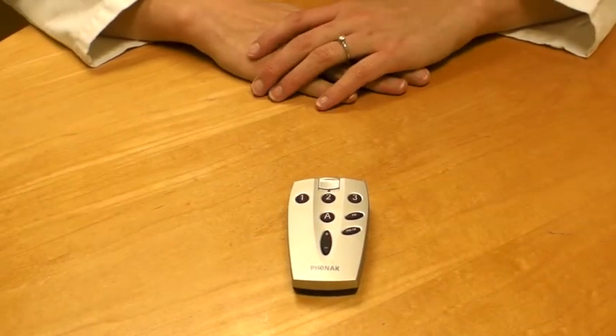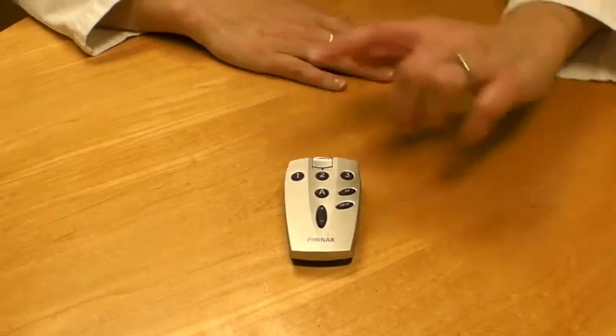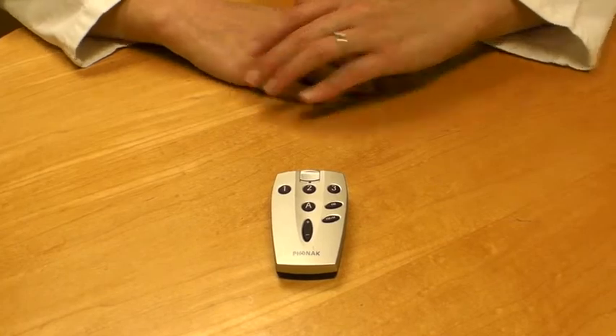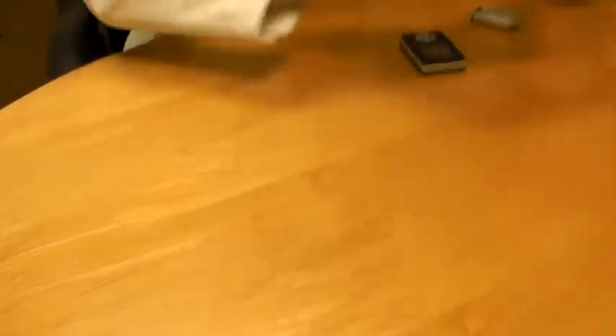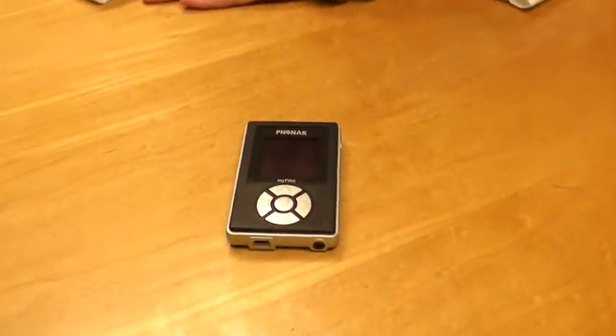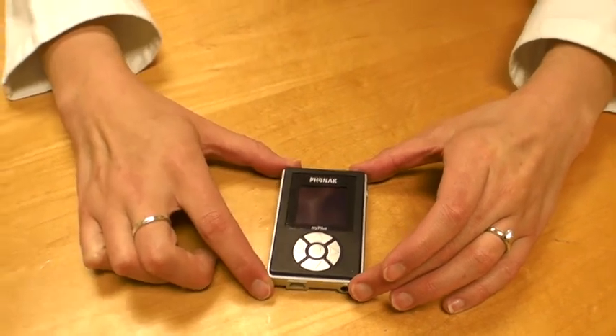Now, some people use an FM system. In this case, this remote control would be ideal for them because you can change components of the FM system using those buttons. And finally, a remote control might look something like this. This is a little bit bigger but it also has a nice screen so you can see what you're doing.